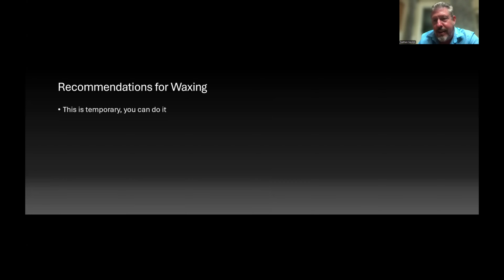This is a temporary thing. It's transitional. You can do it. You can do this. You did it in school. You can do it again. The wax up is practice for doing this in the mouth. You're going to have to do this in composite. Do it in wax first.